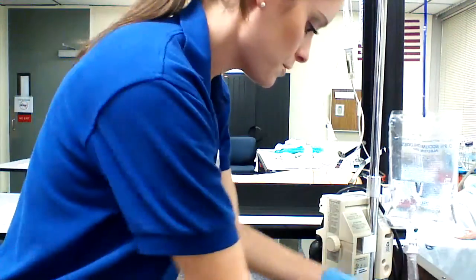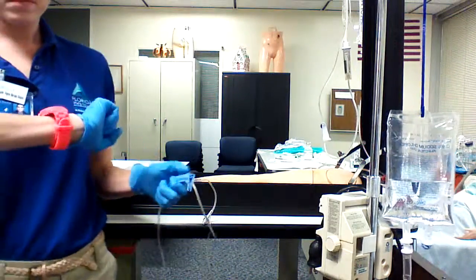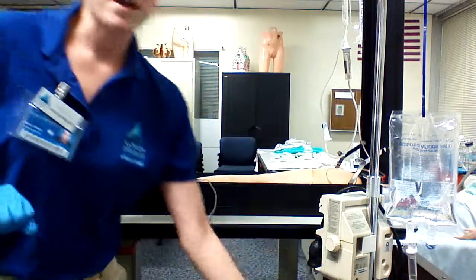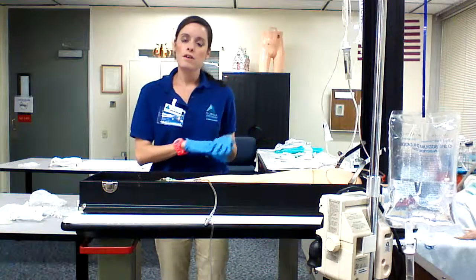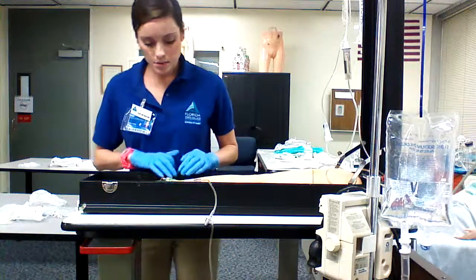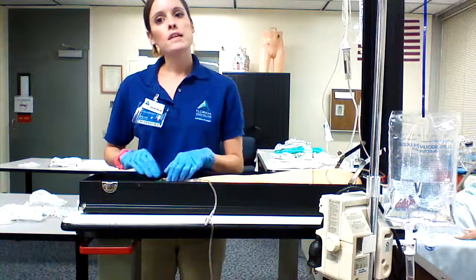And I'm going to reestablish the flow rate of the primary tubing. So the primary tubing flow rate is reestablished. I'm going to dispose of all of my needles and syringes into the Sharps container. I'm going to monitor the site for pain, swelling, tenderness, or redness.